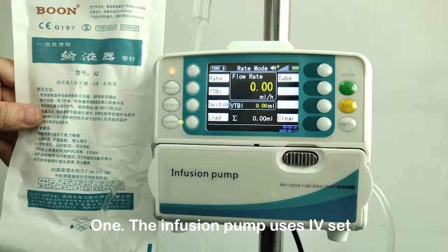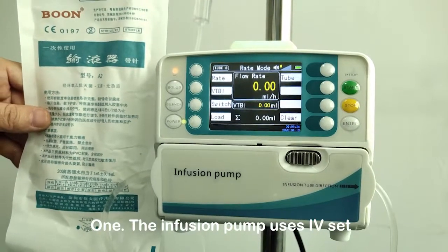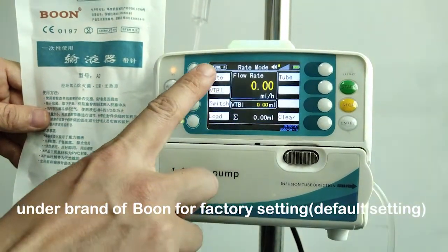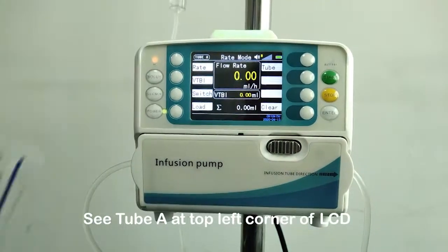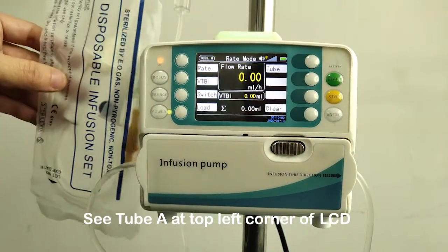Make calibration and verification when changing to a new brand of infusion set. The infusion pump uses IV set under brand of BOON for factory default setting. See tube A at the top left corner of the LCD.